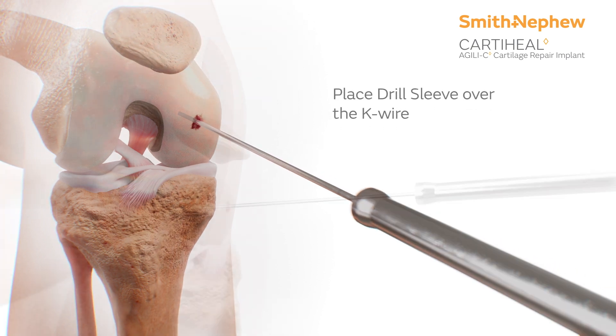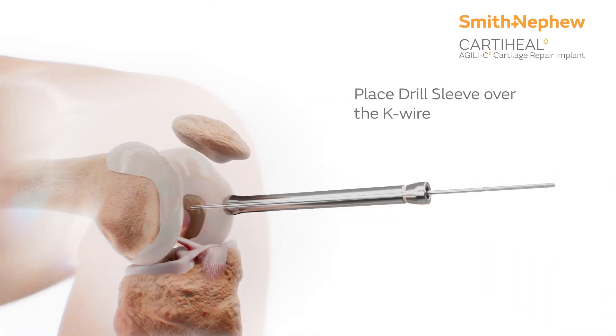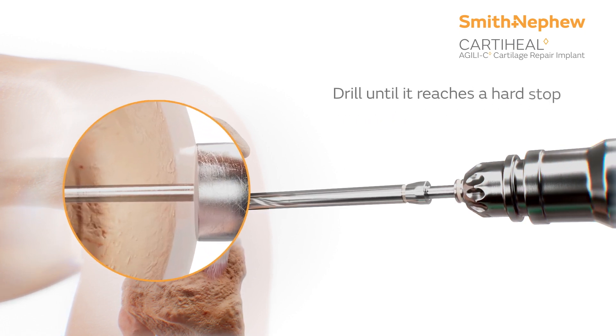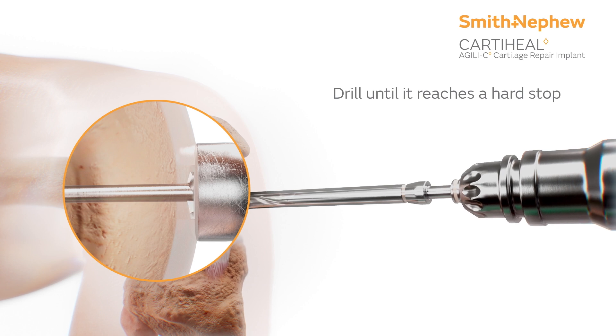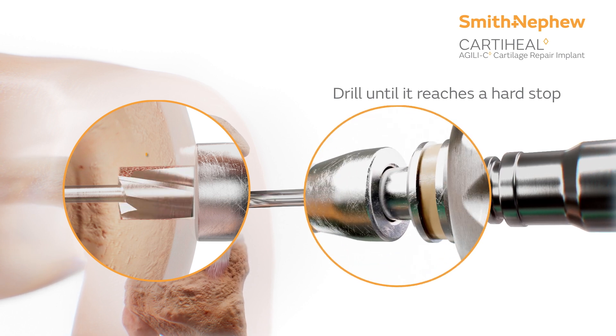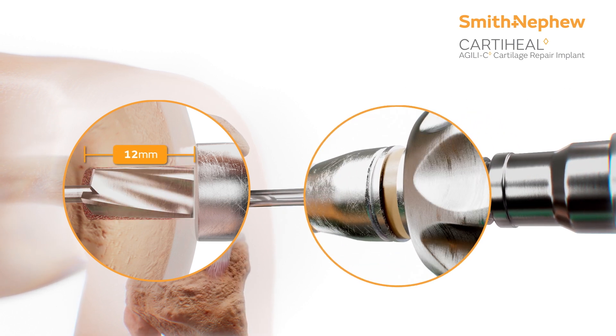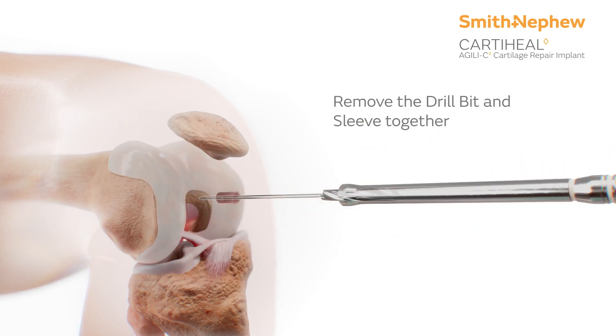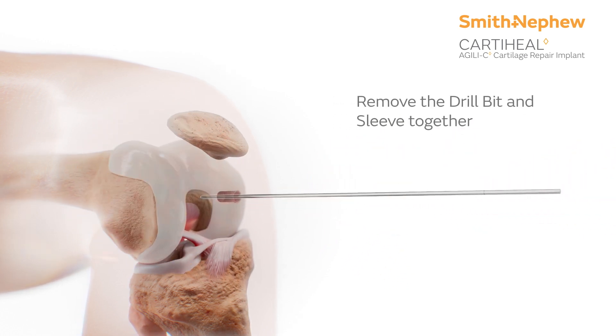Then, place the drill sleeve over the K-wire. Holding the drill sleeve firmly against the articular surface, place the drill bit into the drill sleeve over the K-wire and drill until it reaches a stop. Then, remove the drill bit and drill sleeve together, leaving the K-wire in place.